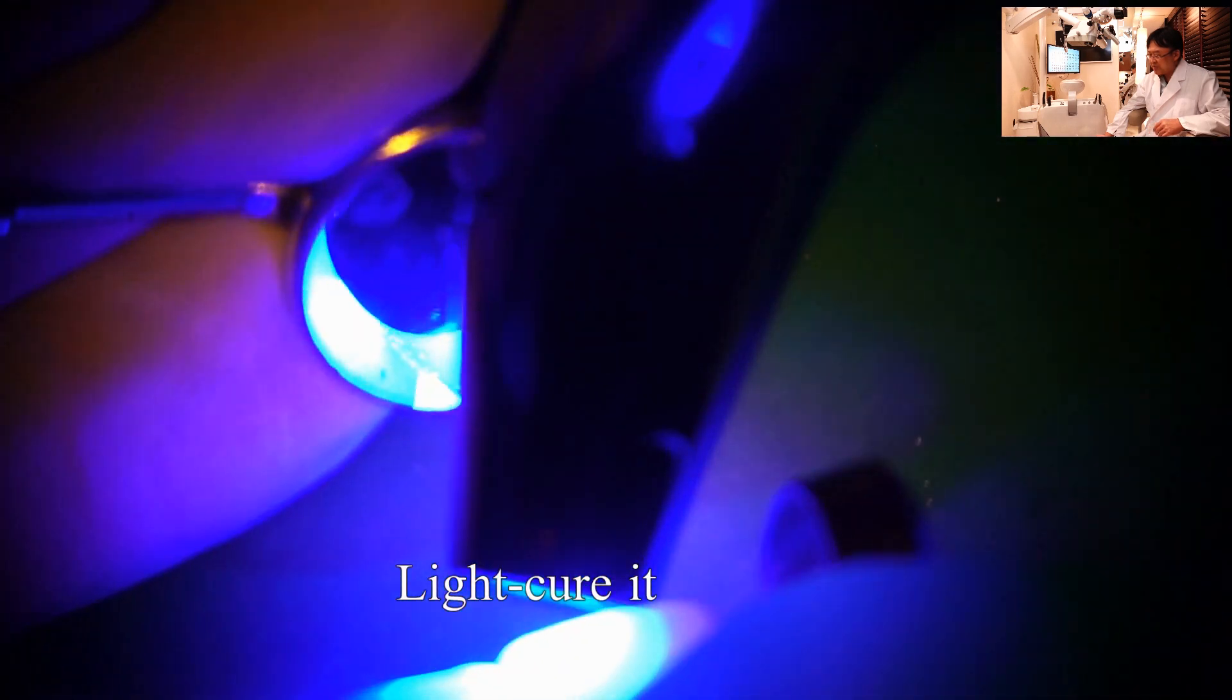And light cure it. This is a very strong curing light, so it takes only 9 seconds.